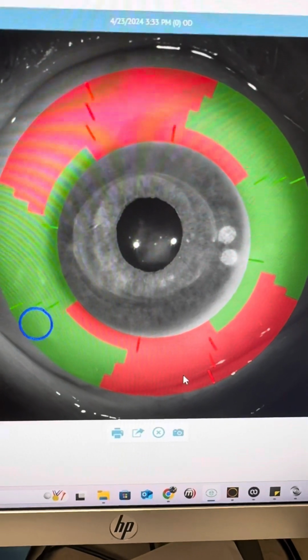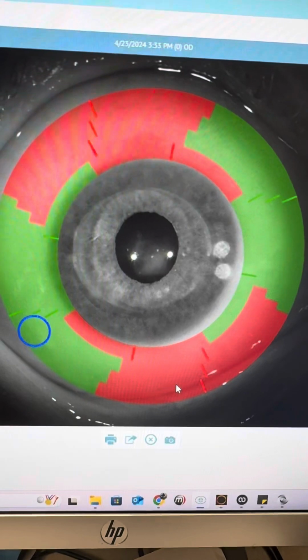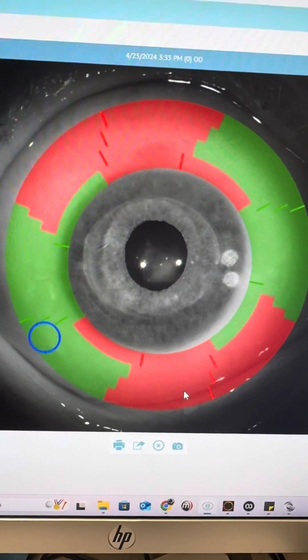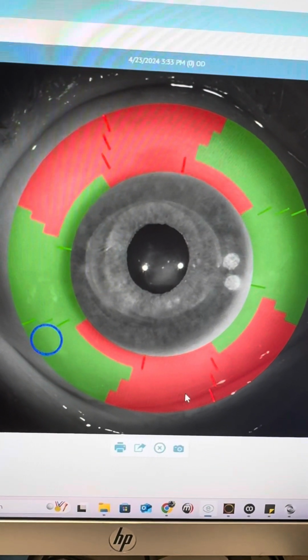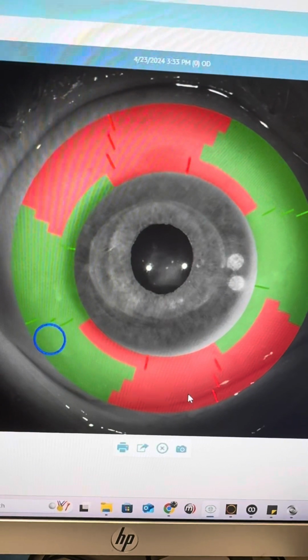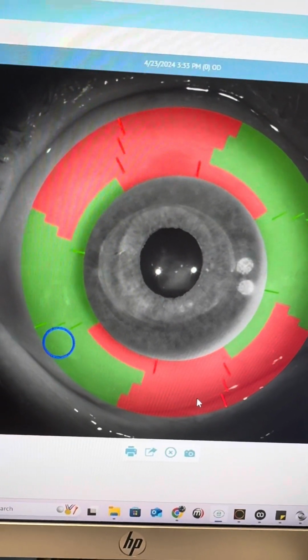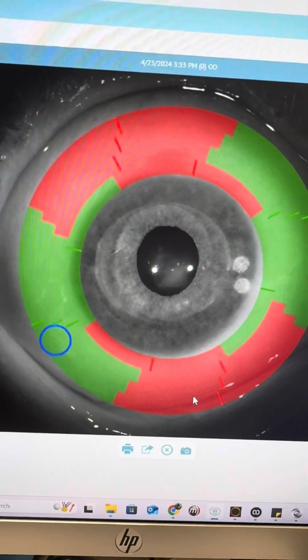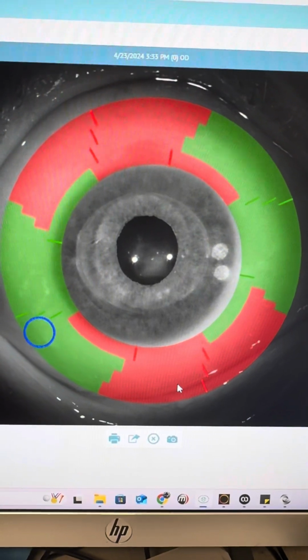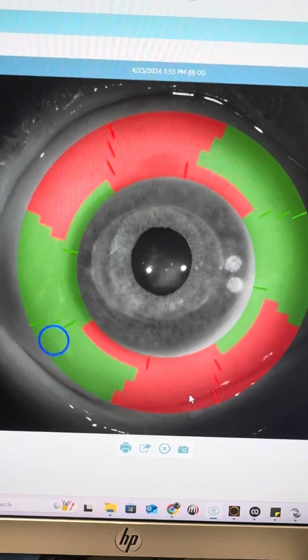The same thing goes for over refraction. Now, if you have a good fitting toric scleral contact lens, then usually you're just gonna have a spherical over refraction because that scleral lens is perfectly round on the cornea. So usually it's just spherical. If you have a poorly fitting lens, or if the patient's cornea is just that jacked up, then you may have a cylindrical over refraction.